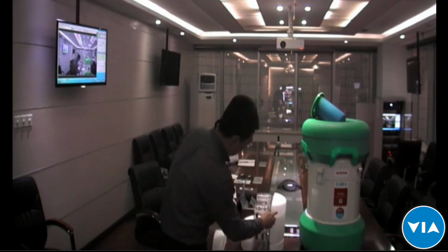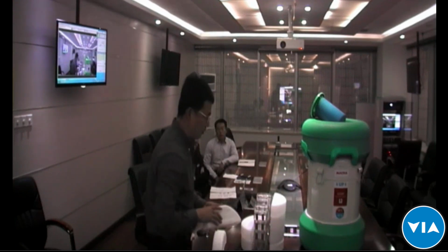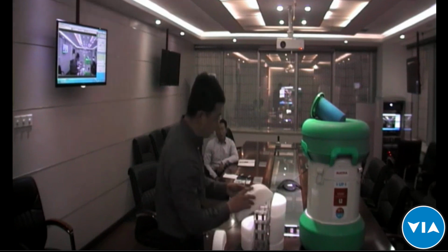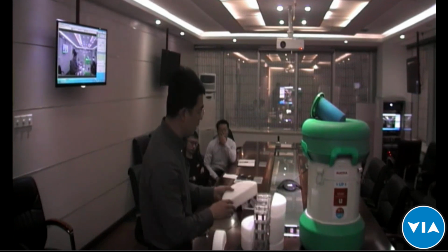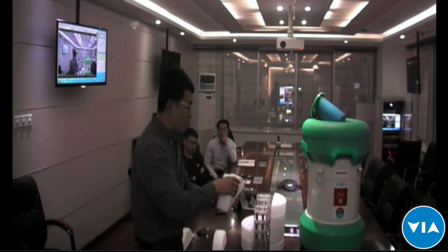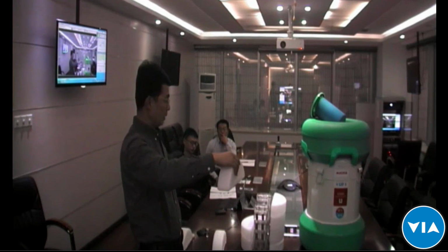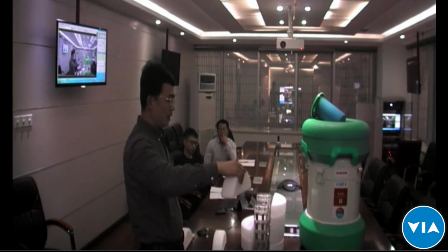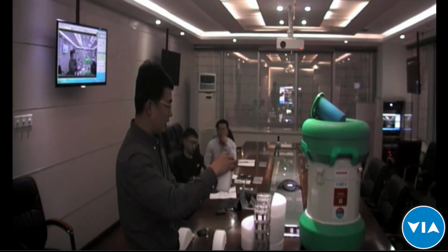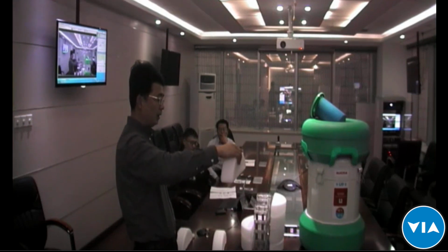The first 1, 2, 3, 4, 5, 7 are easier to replace, but the last one is very difficult to replace into the Arktek. So lastly I want to demonstrate to you how to insert the last ice block into the device. For the last ice block, we need to position the ice block like this.